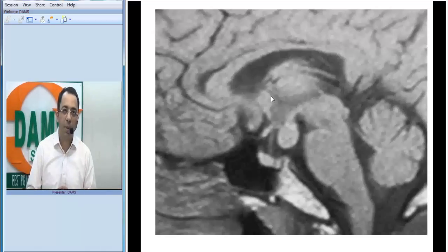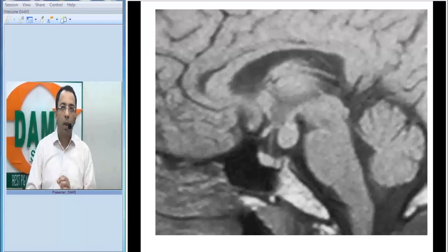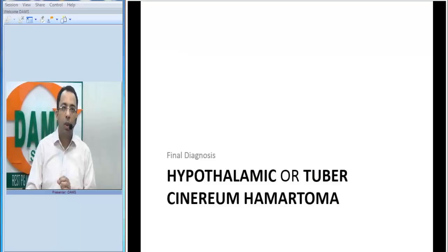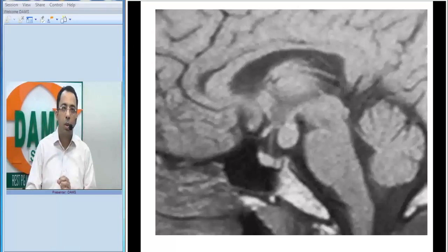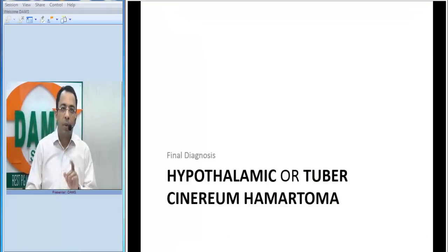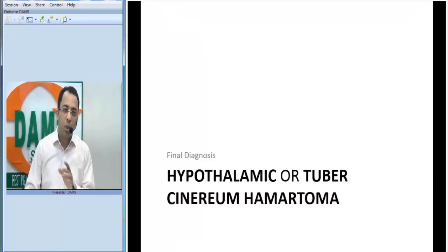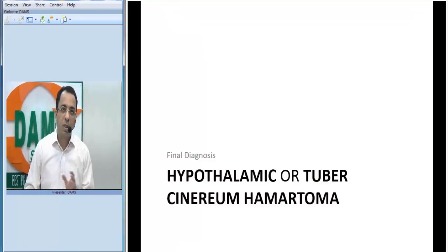We are looking at a hypothalamic hamartoma, also called a tuber cinereum hamartoma. It is a hamartomatous lesion. I want to introduce a few take-home messages which you need to remember.